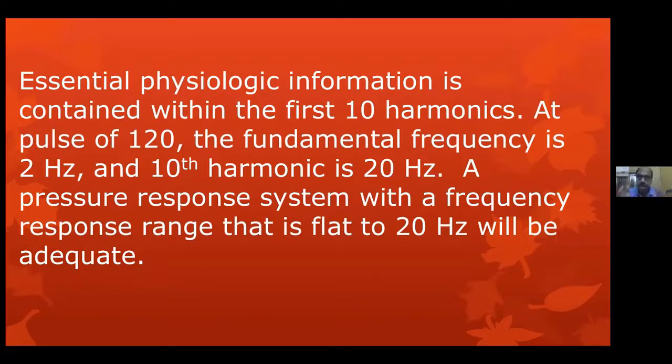Since catheterization procedures give us the opportunity to assess the hemodynamic gradients much better, our knowledge is much better when you refer for a transcatheter procedure, whereas in surgical procedure we don't know. Now the question is, whenever a person is having 64 peak and 40 mean, instantaneously you are not going to be referring to surgery. There should be some other additional criteria.